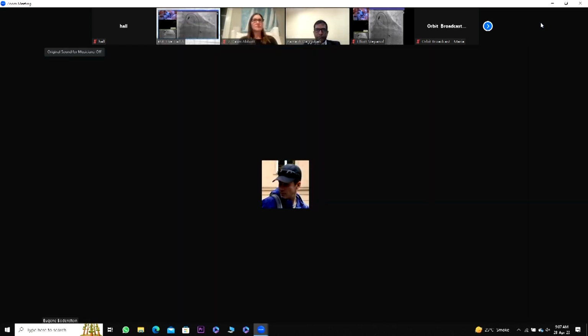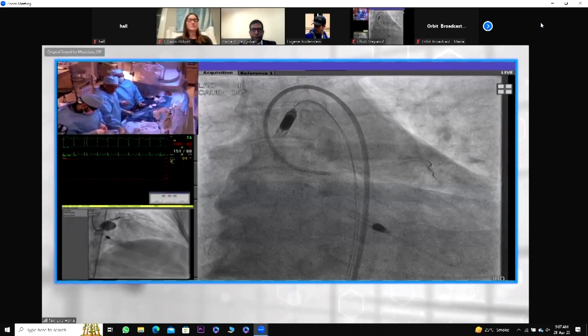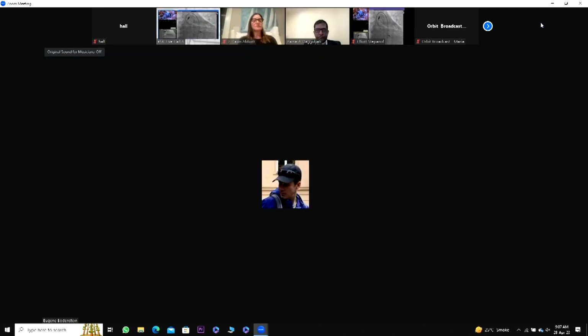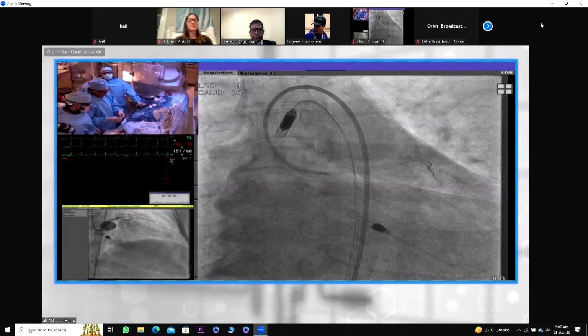We could absolutely, now we've already stented it, but yes, that's obviously a great strategy to just put a wire in the sinus there. So right now, we're going to quickly pot, recross, and finish with a KISS. Yeah, because your left main is stented, we should be very cautious about longitudinal compromise by the guiding catheter.